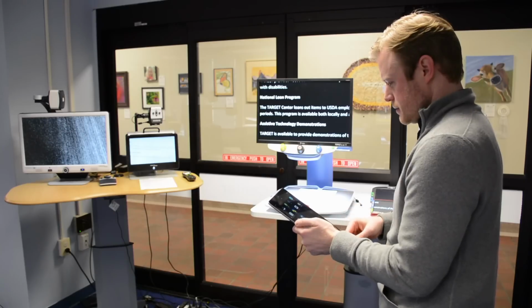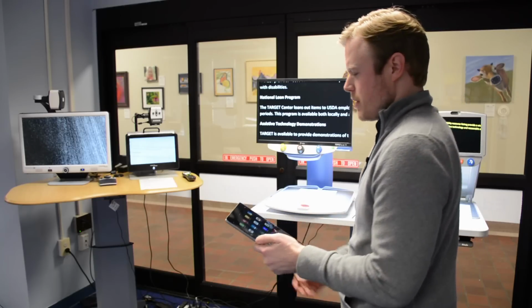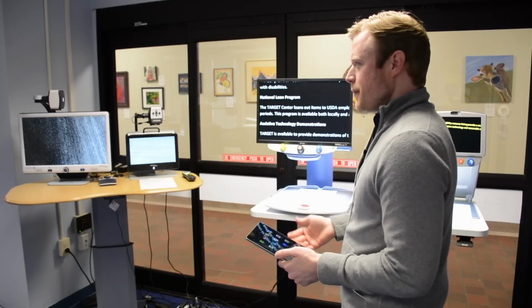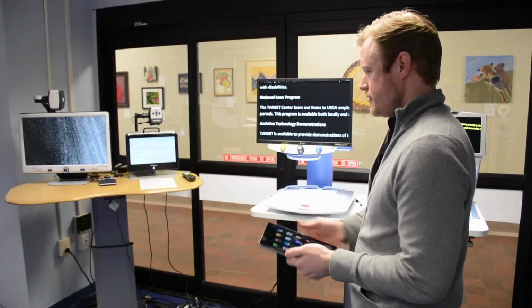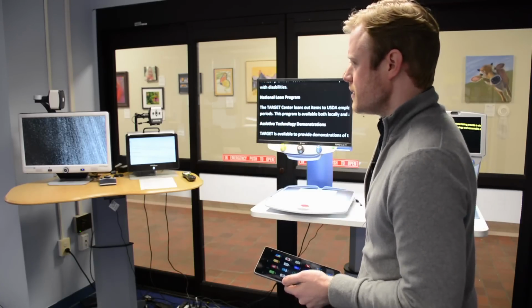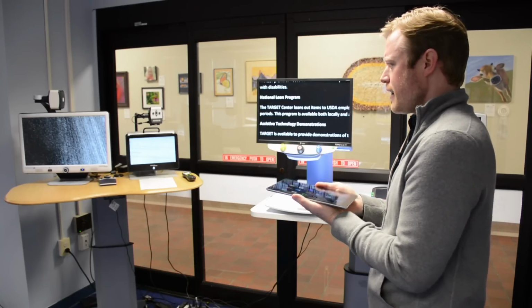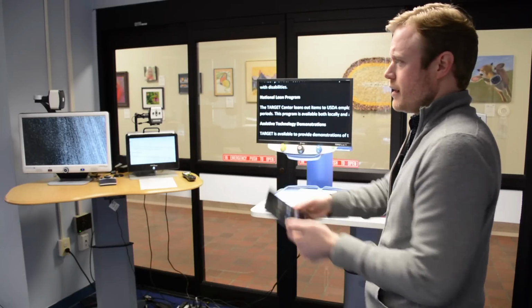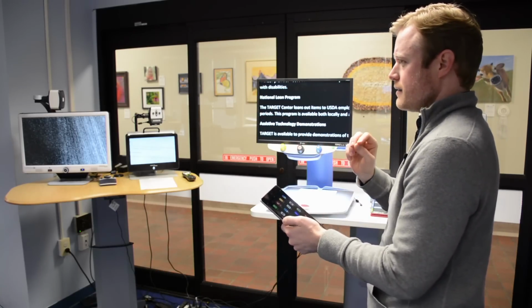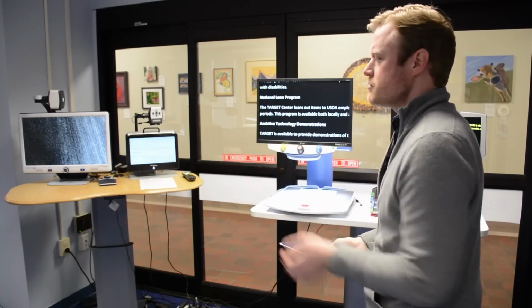Oh yeah, we don't have it on this iPad, but we have it on one of our iPhones. There's an app called the KNFB Reader app. It's similar to the OCR function that's on the large CCTV, the DaVinci. You hold the phone above text, or if text is on the wall, you can hold it there and snap a picture of it and it reads it back to you, and you can change the font size and the contrast in that.